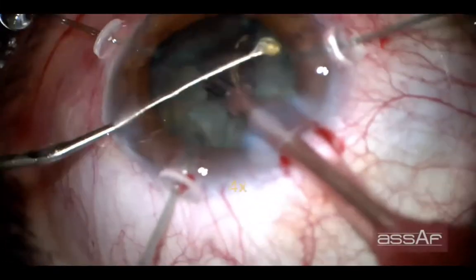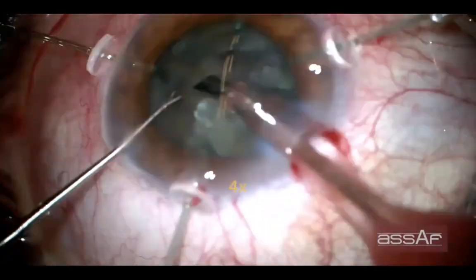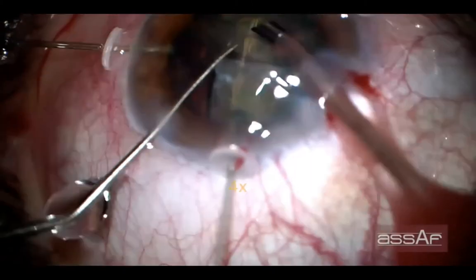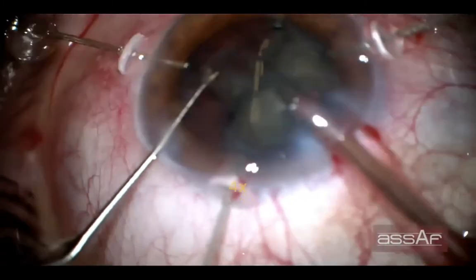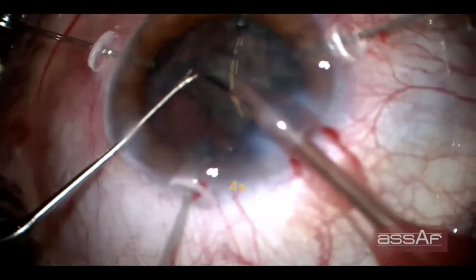As you can see, we can apply any technique. You can see here, this is the quick chop technique, or we can apply the stop and chop technique, divide and conquer, whatever. You can see that I'm doing phacoemulsification very comfortably, and this part of the surgery is very routine, so I had to fast forward this part of the surgery.